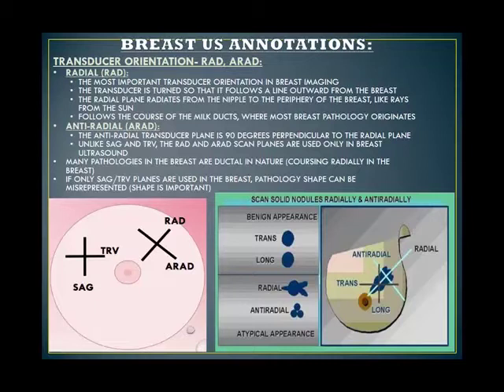When we're imaging, we want the notch to always try to face the patient's right side or face the top of the patient. As I'm going through, I'm trying to keep to that as much as possible. It gets tricky when you get over here. You have to flip your transducer around and start going the other way. So we want to remember that our notch faces the patient's right or the patient's head, as closely as you can. We're going to learn that in a minute too.